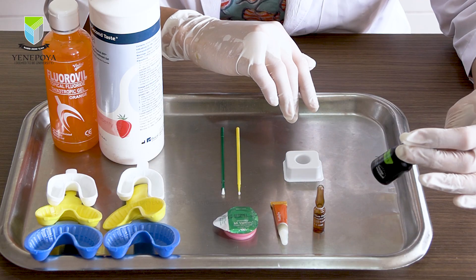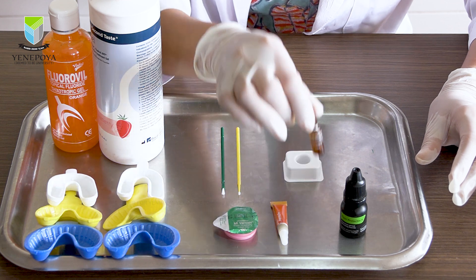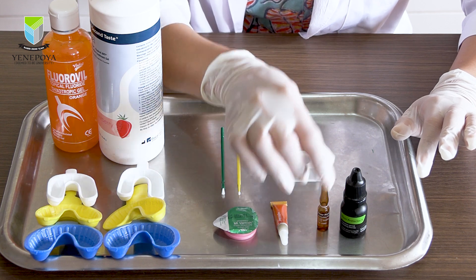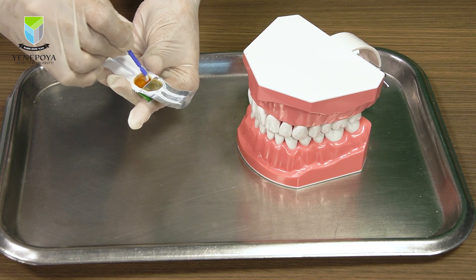When using a varnish, always make sure to read the manufacturer's instructions beforehand, because some brands say you need to dry the teeth prior to application while some brands say it's not necessary. Once dry, start application without any delay.